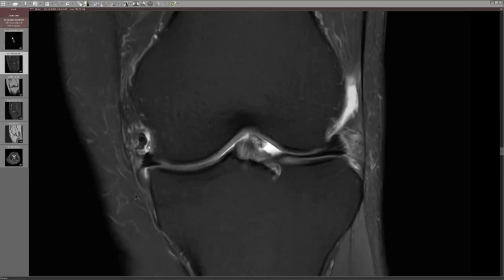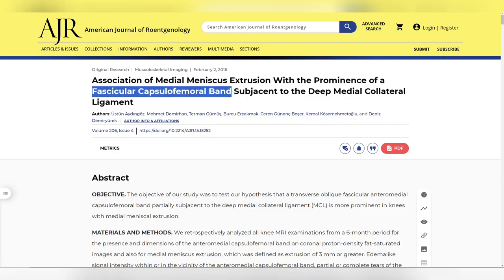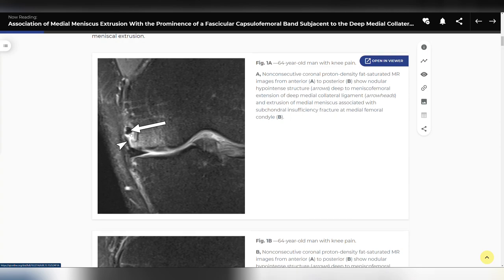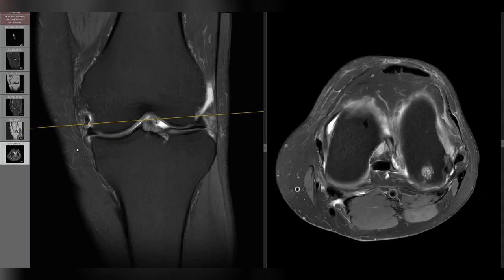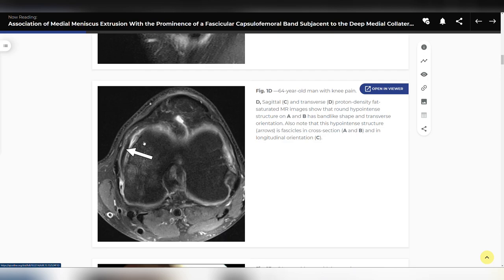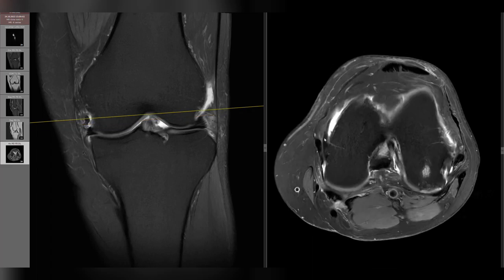Here is the reference: a 2016 paper in HR titled 'Association of Medial Meniscus Extrusion with the Prominence of a Fascicular Capsulofemoral Band Subjacent to the Deep Medial Collateral Ligament.' You can see in their images the same appearance — a nodular change close to the deep MCL fibers. On axial images you can see it has an abnormal course, not the deep MCL, with a band-like shape in the transverse orientation with a slight oblique component.